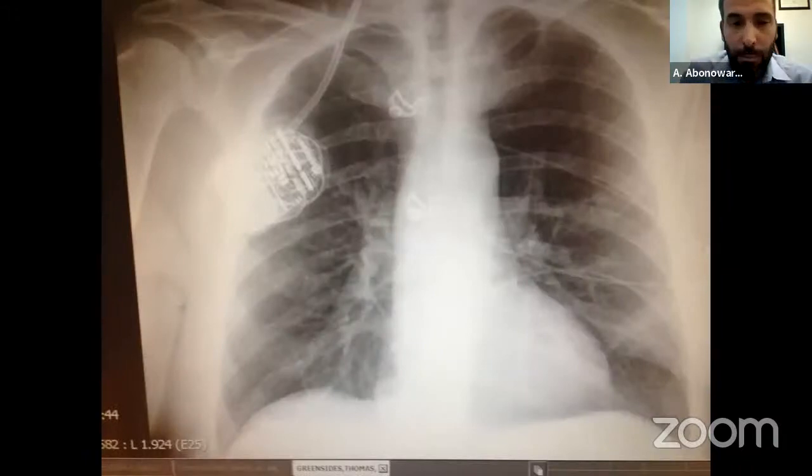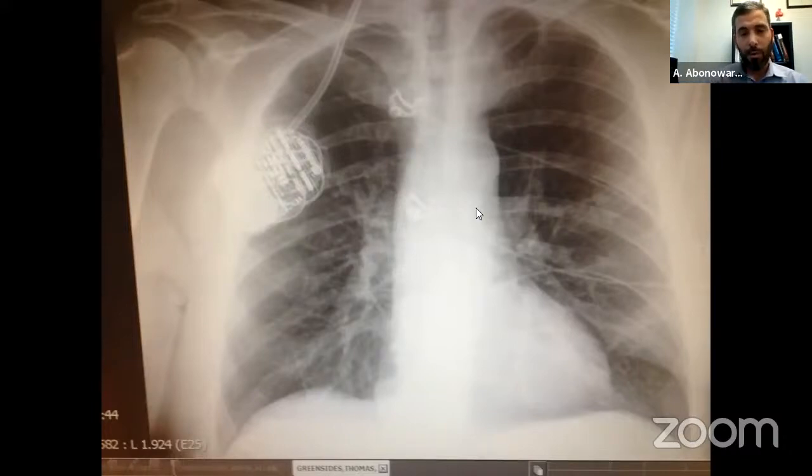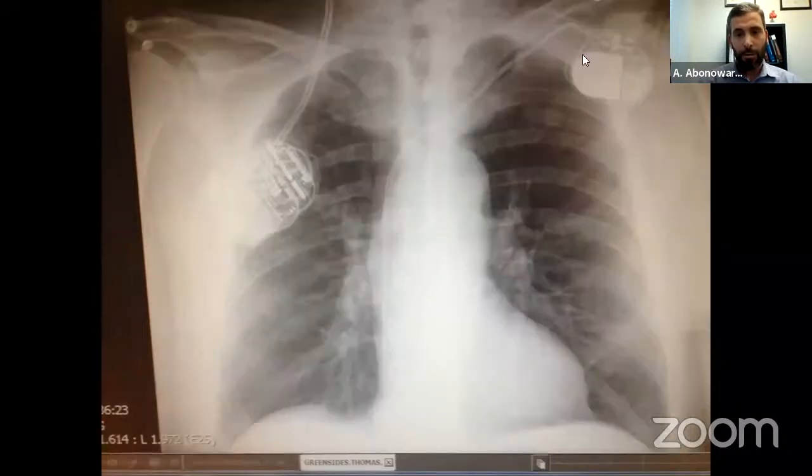You may see a patient come in, this is for the operators. I have seen a couple of patients with nerve stimulation devices, and what to do about that. This patient comes with a complete heart block. So I needed to speak to the company to make sure there is no interference with the new pacemaker. Eventually the patient got the pacemaker and everything went very well. So you may see two devices like this, if there's a neurology system and a cardiology system. This is a nerve stimulation device that goes to the brain and this pacemaker goes to the heart.